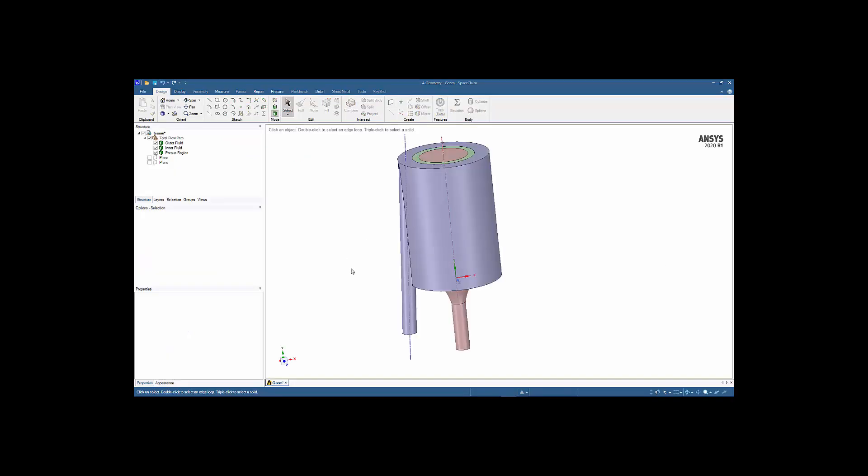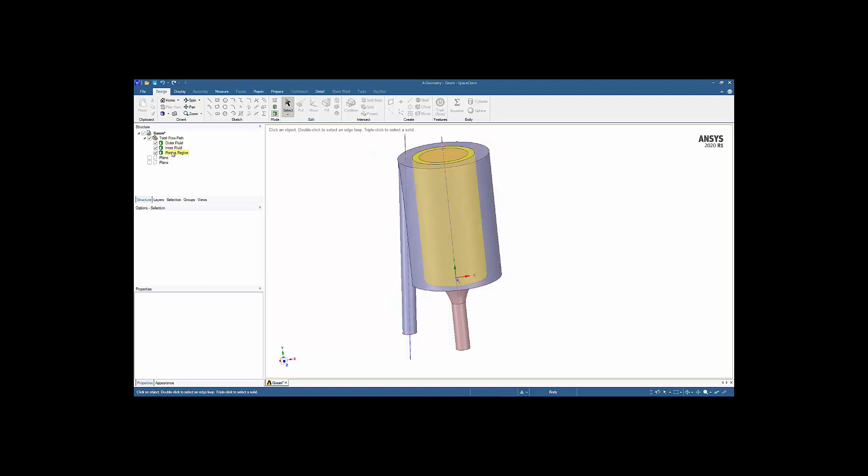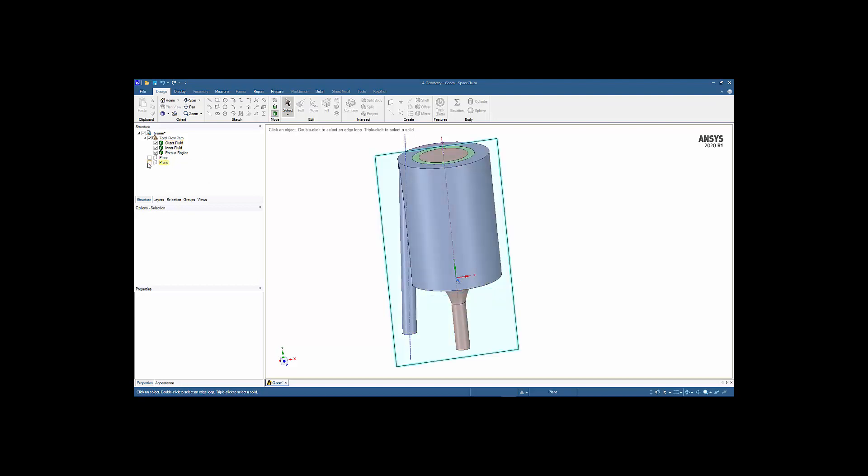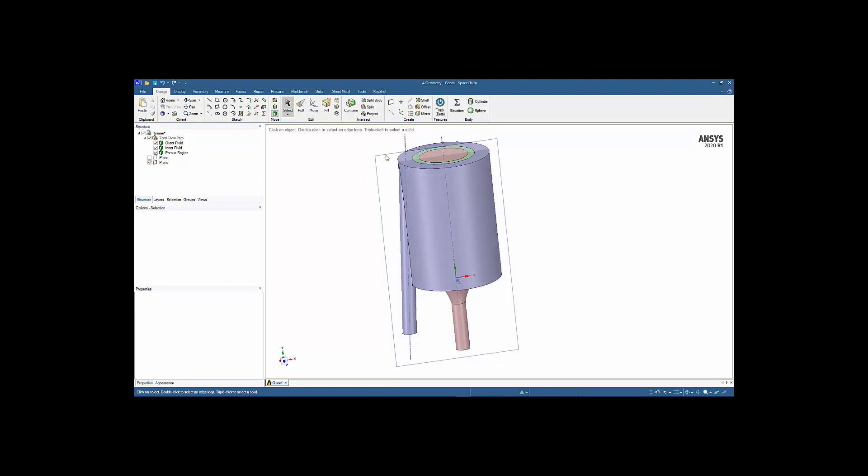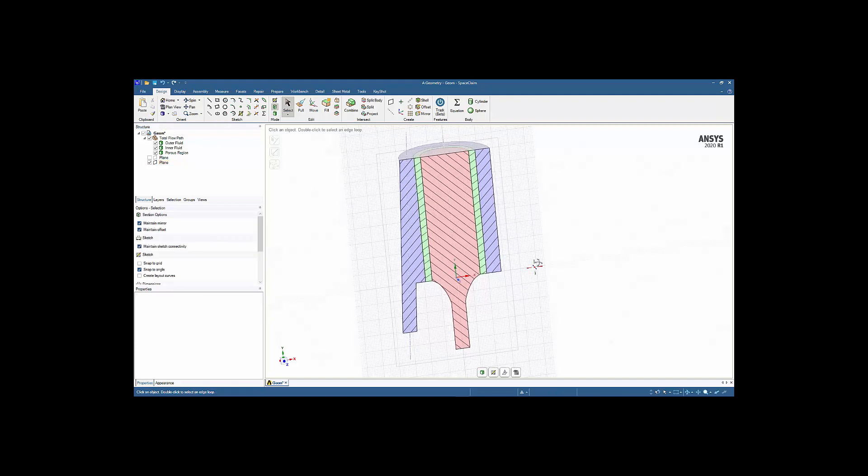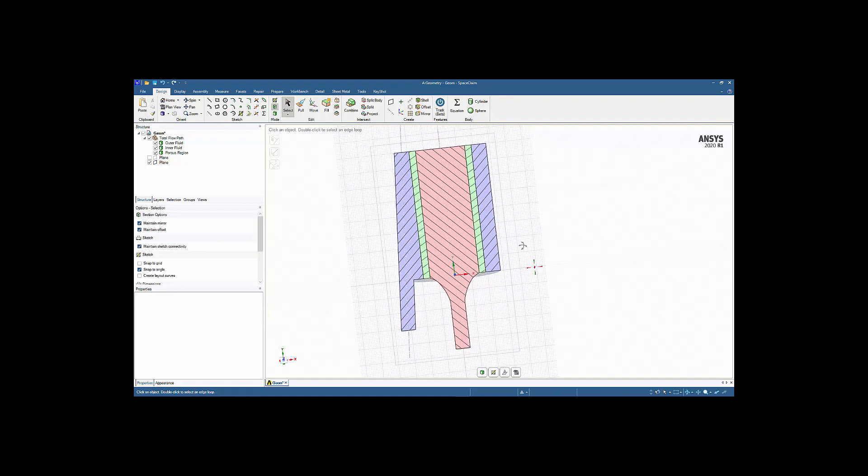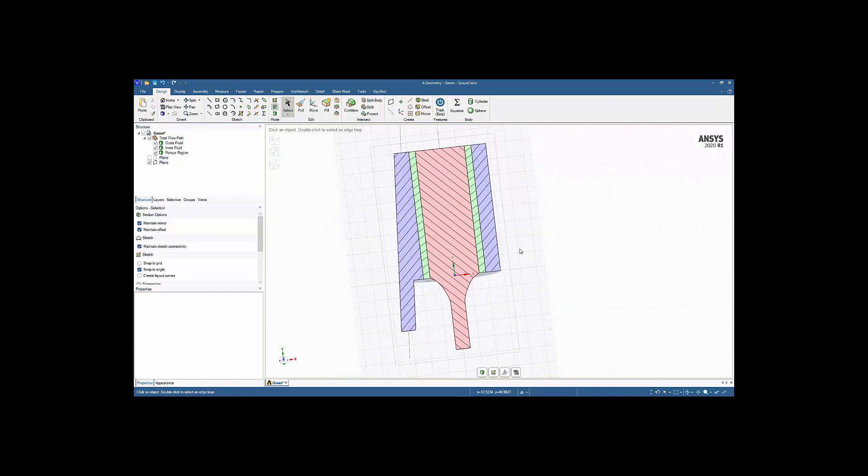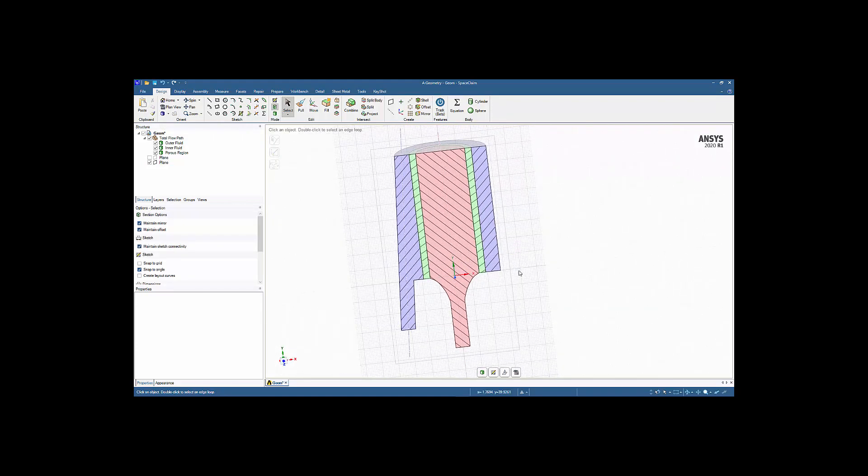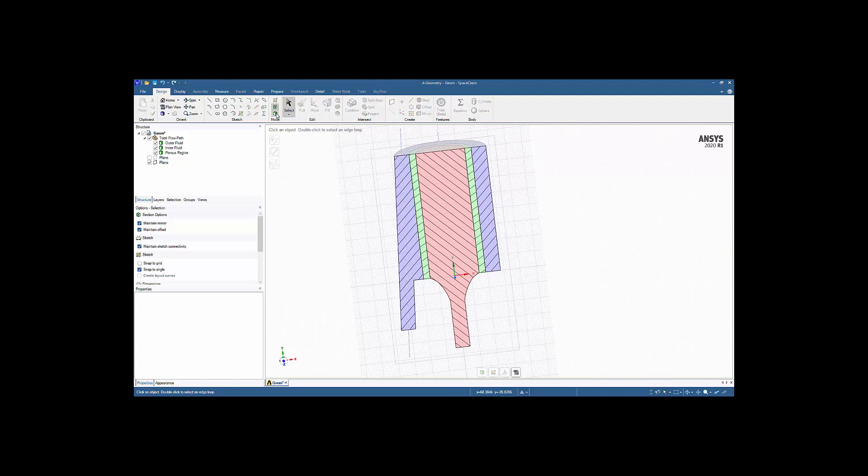This is Space Claim, which shows again the three different volumes that we've created. We have our inner fluid path, we have our porous media region in the middle, and we have the outer fluid path surrounding that. We've also created some planes here to do some cross-sectioning. For instance, if we were to click on this plane and select that plane and go to cross-section mode, we can then clearly see the interior of the flow path, which is really quite helpful.